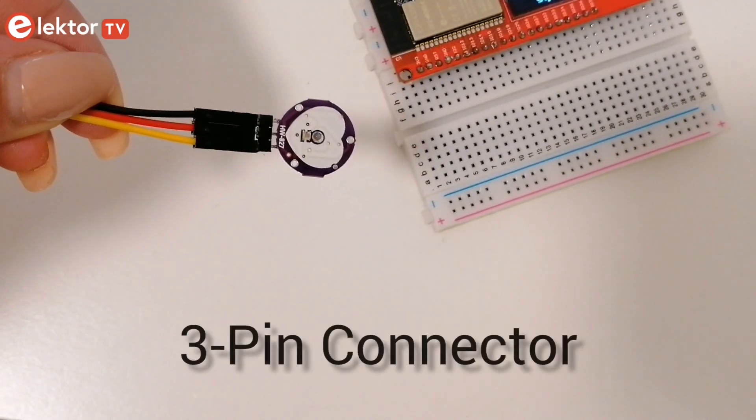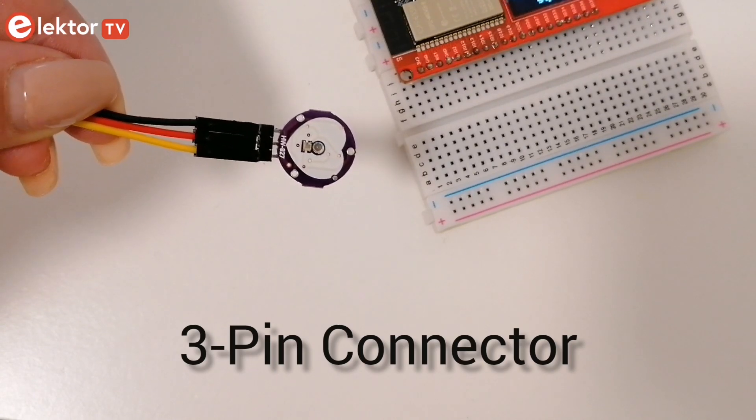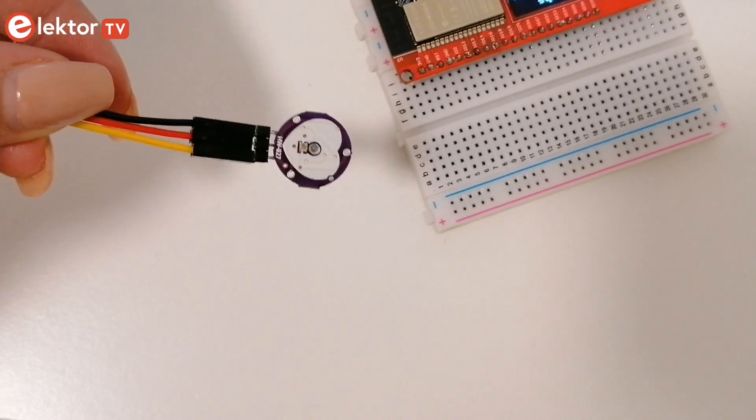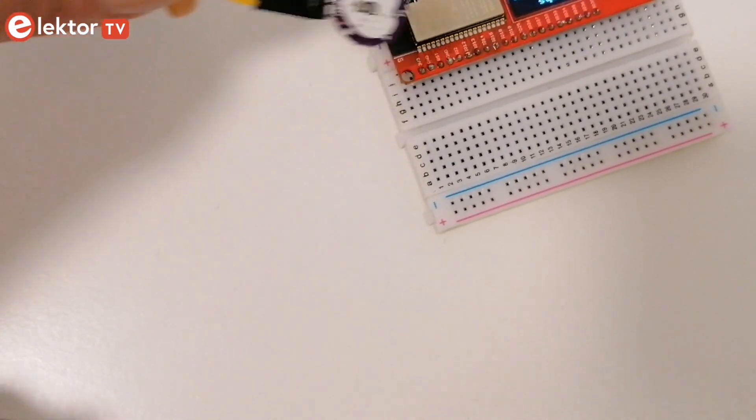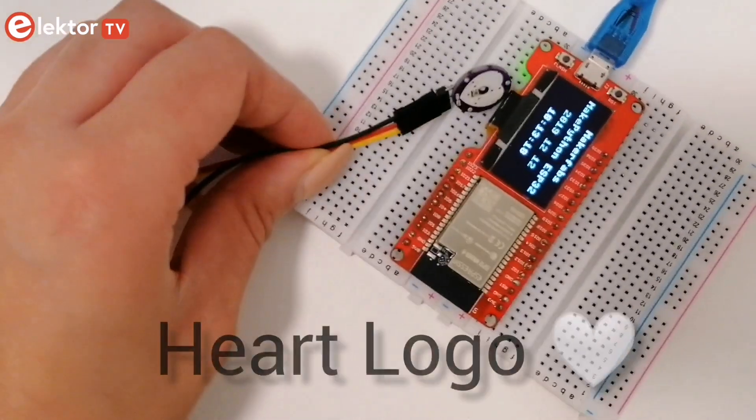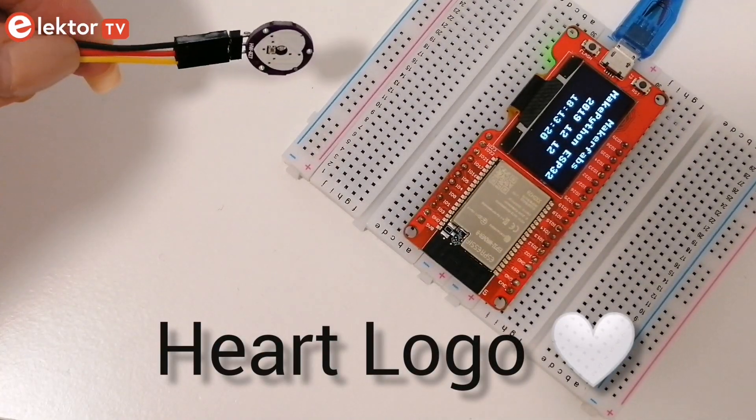A three pin connector is supplied in the kit and it should be soldered to the three pins on the device. The side with the heart logo is the one that contacts the skin.